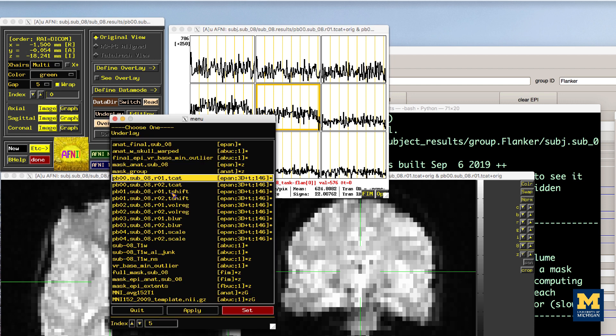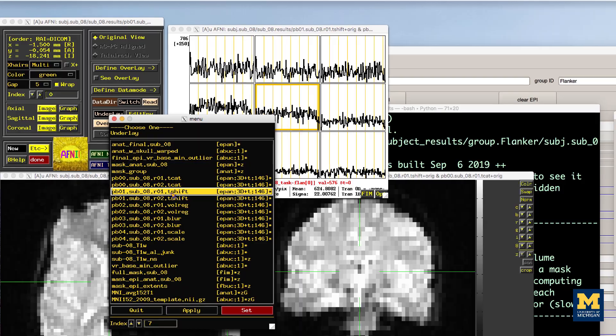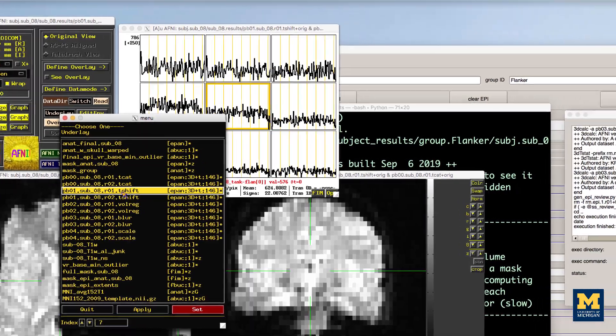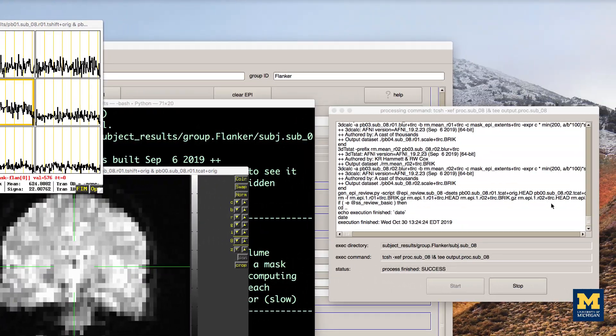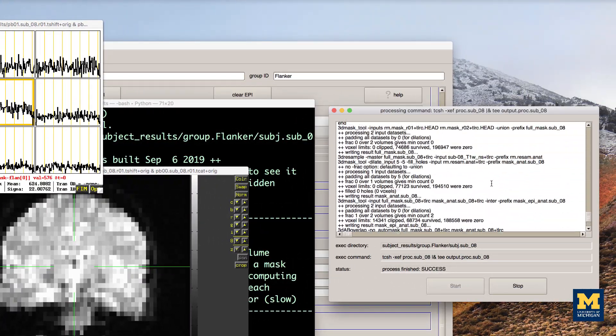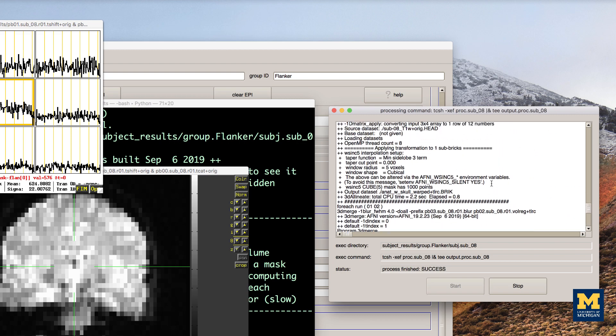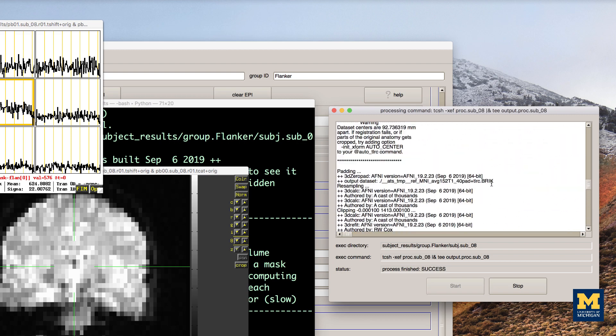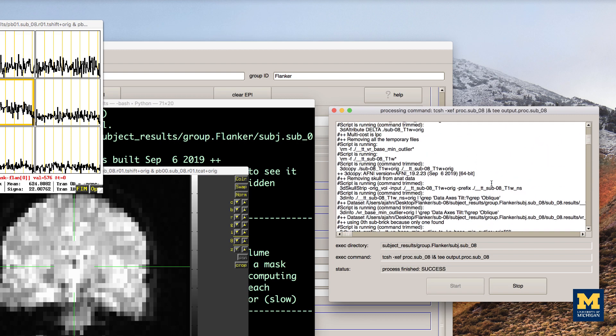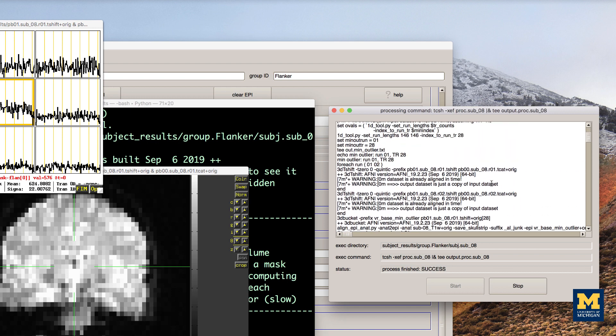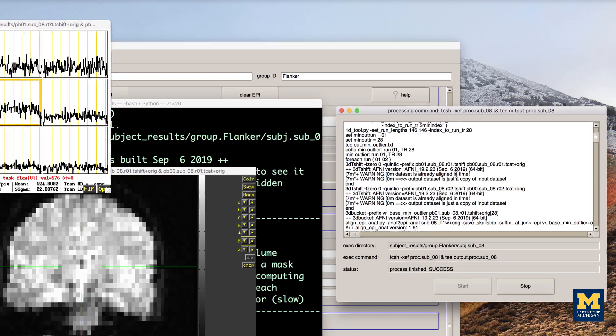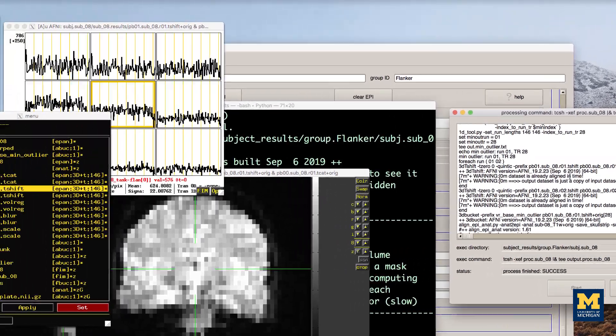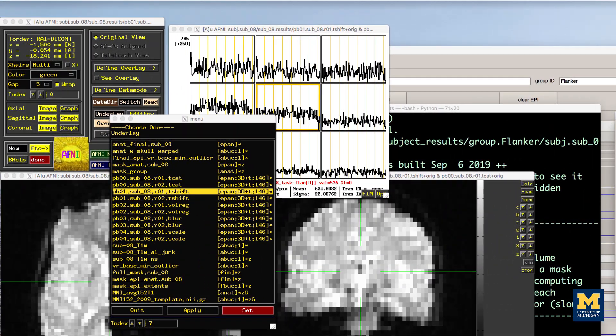Similarly, the pb01 images should be the same as the pb00 images. If you examine the output text from the preprocessing, you will see a message printed during 3D tshift, which states that the datasets are already aligned in time, and that the output dataset is just a copy of the input dataset. For now, just make sure that the two processing blocks look the same.